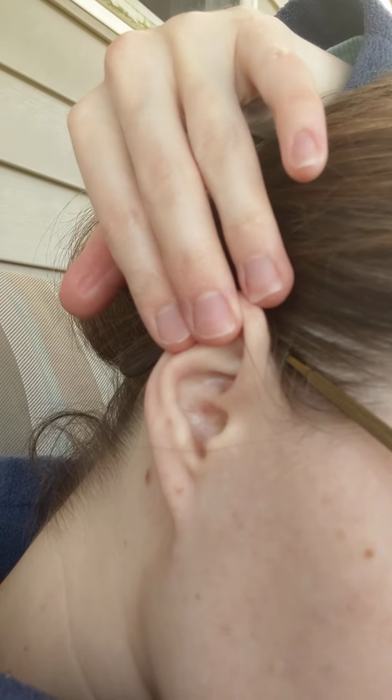I have used all kinds of hearing aids. I've used in-the-ear ones, hate them, wouldn't recommend it. That's just me. If it works for you, that's cool. Plus, my ears are very small. I don't know if you can see, but my ears are very, very, very small, like tiny ears, to where when they make my hearing aids, it's really hard to do because they can only go so deep.